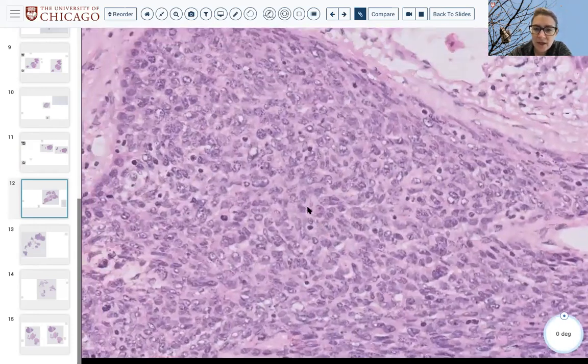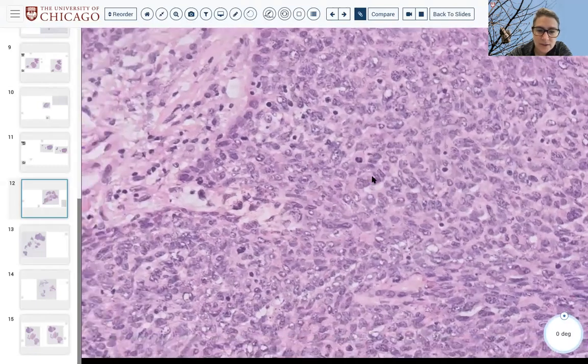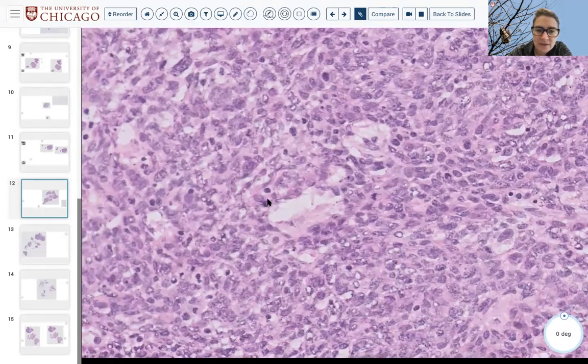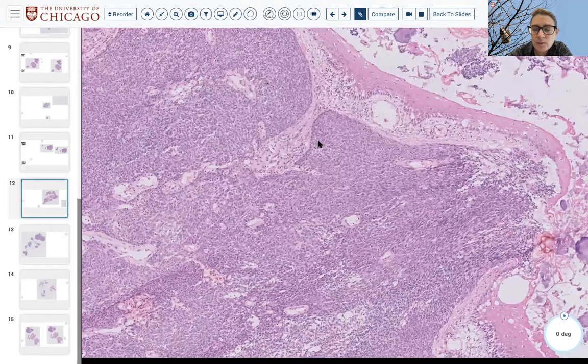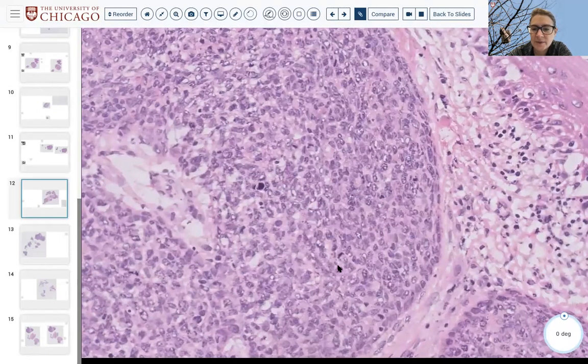And so in the base of tongue and tonsil, okay, one mitosis, another mitosis, a lot of associated maybe small inflammatory cells, another mitosis, very blue, very basaloid, like you said. So in the base of tongue and tonsil, inevitably, what are we dealing with with this morphology? Not only a non-keratinizing SCC, but specifically, why does this person have this tumor?